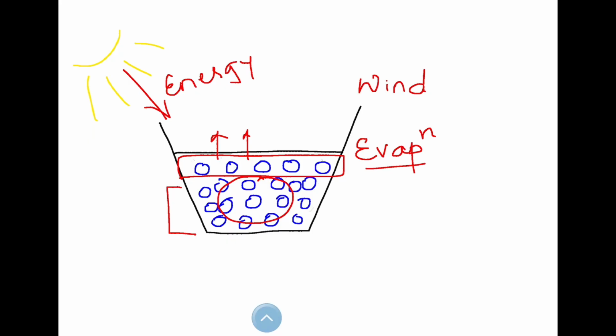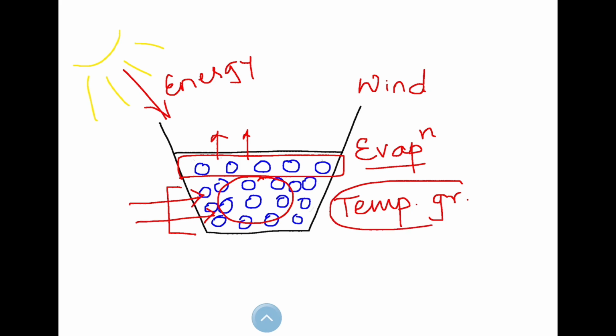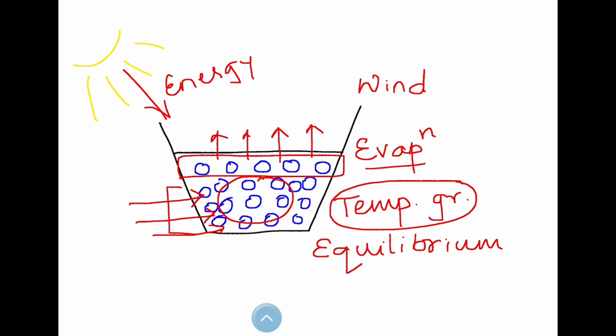The difference in temperature between the liquid and its surroundings creates a temperature gradient. Heat naturally flows from areas of higher temperature to areas of lower temperature. In this case, heat flows from the warmer surroundings into the cooler liquid. As the liquid cools, the temperature gradient between the liquid and its surroundings increases, leading to a greater flow of heat into the liquid. Eventually, the rate of heat flowing into the liquid from the surroundings will match the rate of heat being lost by the liquid through vaporization. At this point, the liquid's temperature will stabilize and the process will reach a state of equilibrium. At this point, the temperature ceases to drop. Thus, if a glass of water or any liquid is left exposed to the atmosphere, the water will eventually disappear.